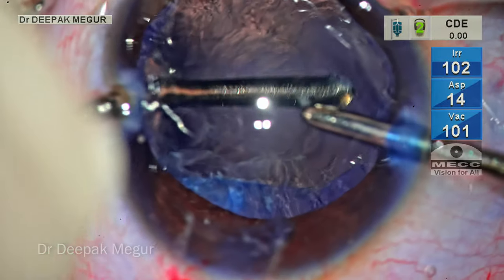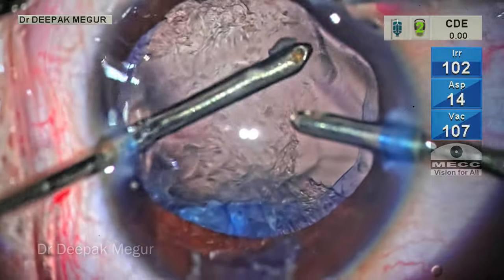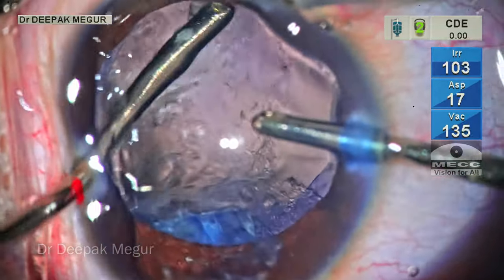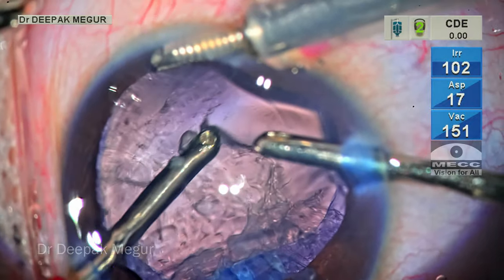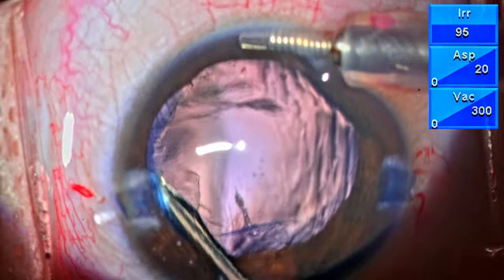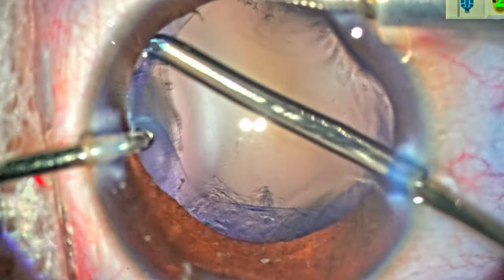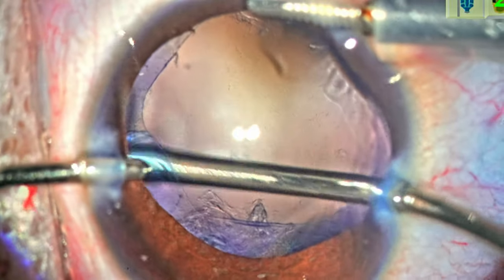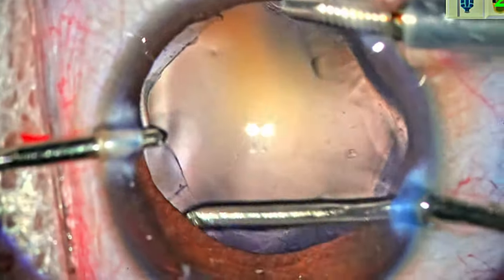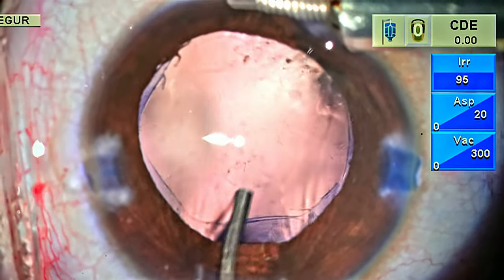Time to aspirate the cortex. The cortex is quite sticky to the posterior capsule and it takes a bit of teasing to remove all the adherent cortex. Eventually, we have a clean capsule.